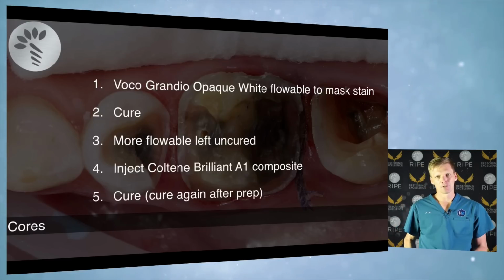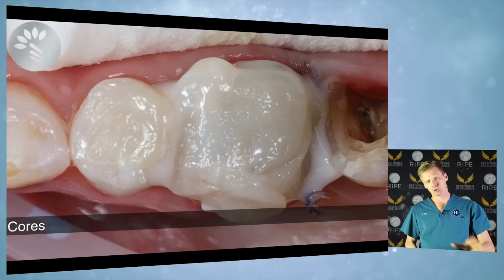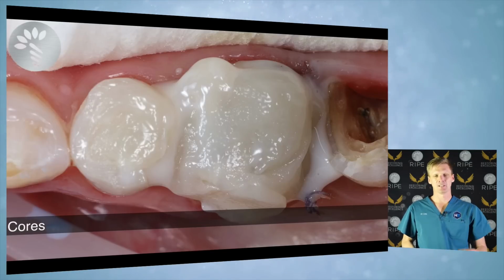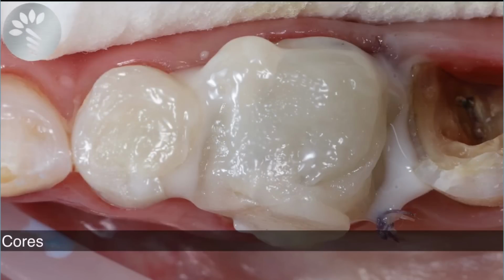Here is an example of giant blob cores, okay? So this is the one I did today. It's 2 side by side. I did them one at a time, but you can see they end up joined together. Now don't just get in there and start prepping blindly. Start on the edge of that core, that blob, and start prepping in, okay?